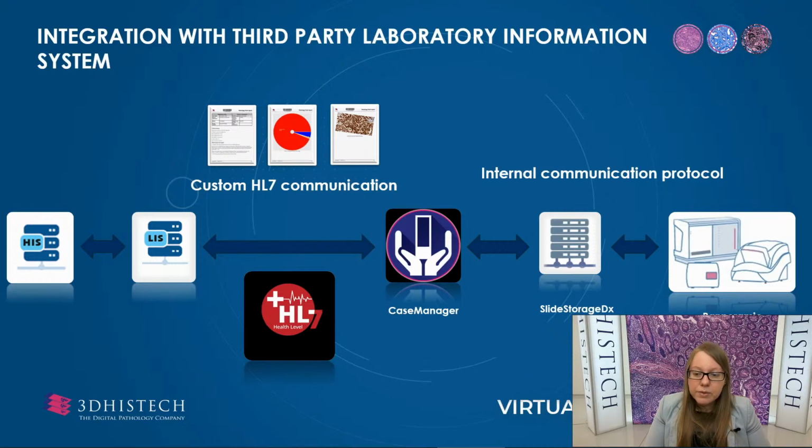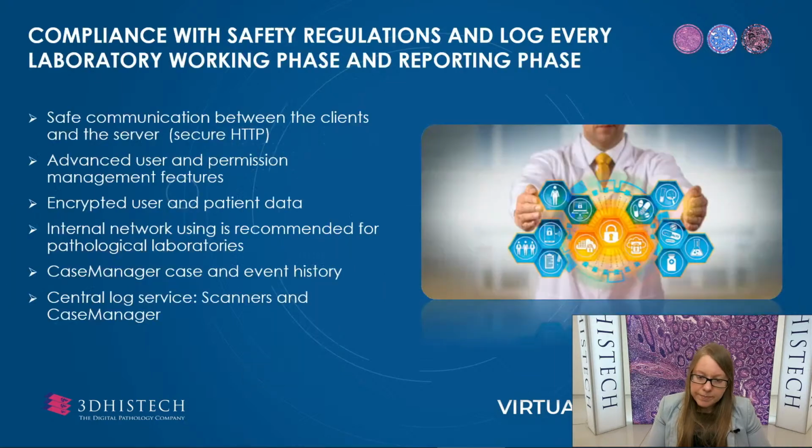When a case is closed in Case Manager, it automatically sends a final report to the laboratory information system, which includes the text and image data, selected snapshots and macro images, and optional attachments. The pathologist can manually push this update from Case Manager to the laboratory information system anytime, even if the case is still in progress.